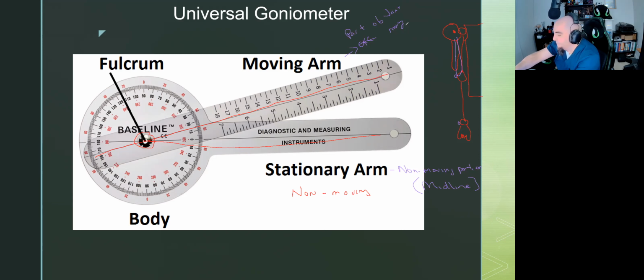Yeah, neutral grip. Because if I stay in anatomical position, it's a lot harder for me to get full range of motion in shoulder flexion. Anatomical position works for abduction, but doesn't work if I keep it this way because I bang off that acromion. So we will move the hand around a little bit for rotation when we're doing different motions. Yes, Josh, and we'll talk about that when we go through each of them.